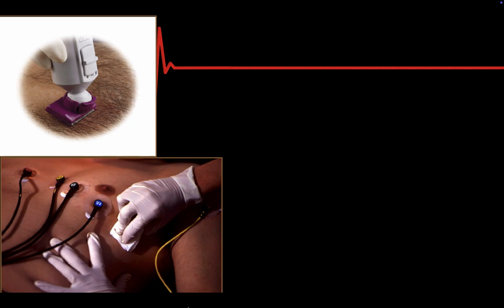If you have hair on the chest, you have to get the hair out of the way. Electrodes that are sort of hovering over the chest don't do a good job of gathering electrical signals. Cleaning the skin is the one that's also overlooked. It's much simpler and quicker than shaving. If you take a 4x4 or any gauze pad and just rub the area vigorously before you put on your electrode, it's going to stick better, it's going to adhere better, it removes oils that can interfere with the signal, it's going to help you get a cleaner tracing.